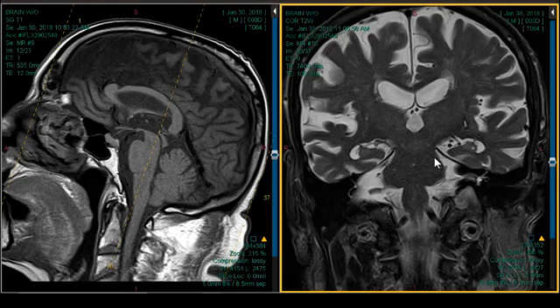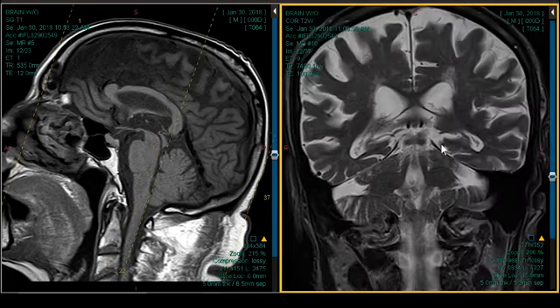So you've got to look at what they're looking for. If they've already said, okay, this person's really going down, and they're looking for a diagnosis, treatment, you're doing them a service. On the other hand, if the patient's fine, and they came in for some other thing, a pituitary issue or something like that, I would describe the findings, but I'm not going to put that. I don't use the word Alzheimer's very much in the report.